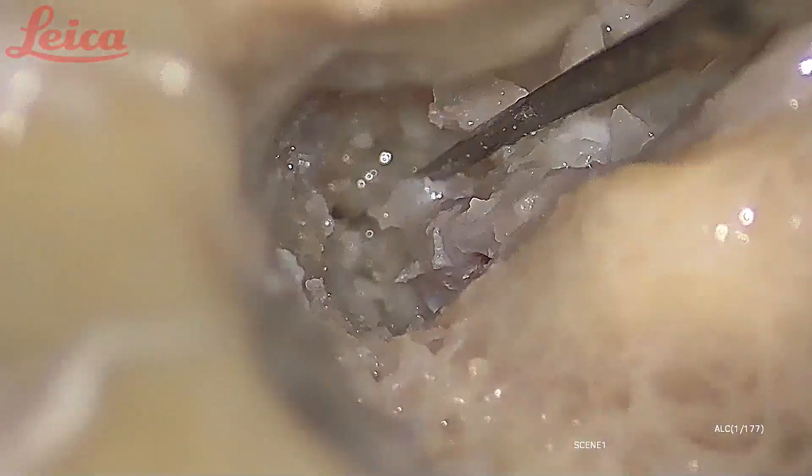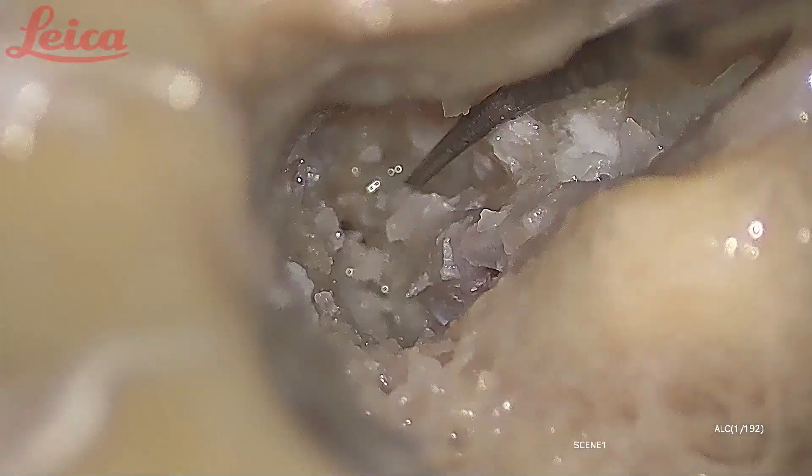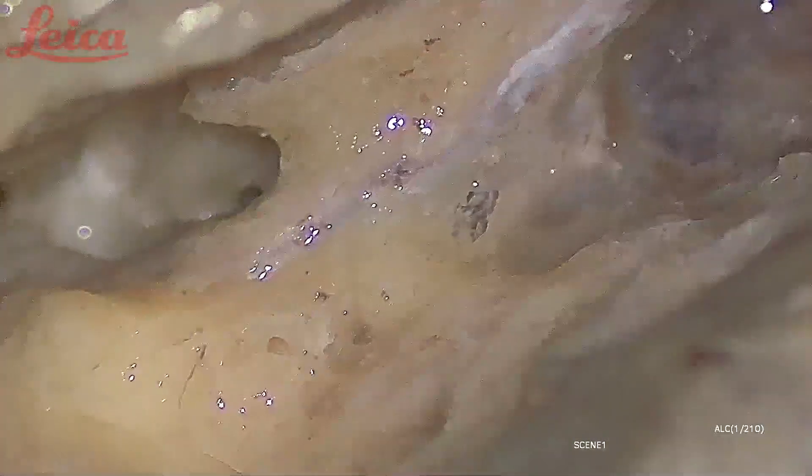This is the GSPN — my instrument is hooked below the GSPN. Starting from the labyrinthine segment, first genu, and geniculate ganglion — this is the GSPN, the horizontal segment, and the second genu. The second genu is usually close to the pyramidal process level, and then the vertical segment. I still have to expose a little bit more of the nerve because for good results in facial nerve surgery, at least 180 degrees of the nerve has to be decompressed.